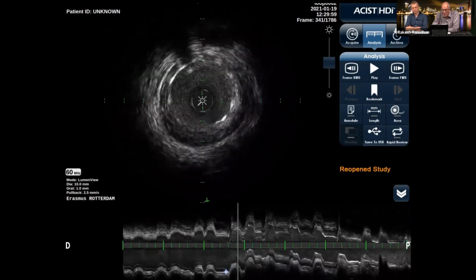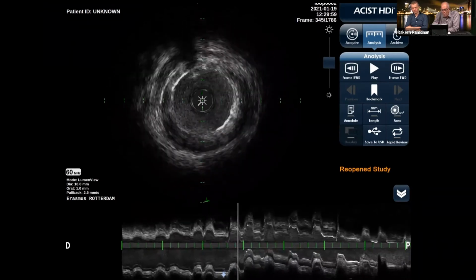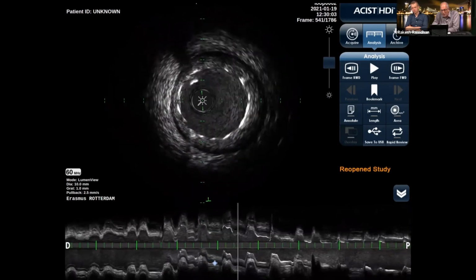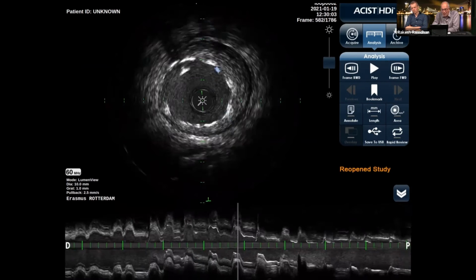We see here the stent, and you see that we have the stent stretch, we have some plaque there behind, and if you compare it, then more proximal, the stent is a bit bigger, but nevertheless everything is against the plaque. Don't bother about the burden behind that, it's all behind the fence.